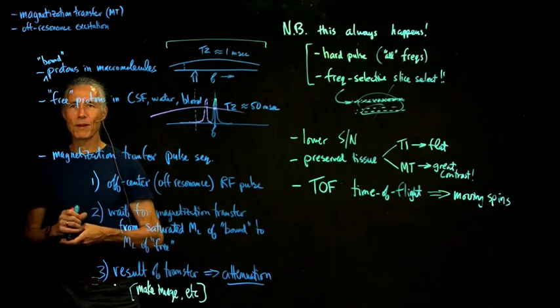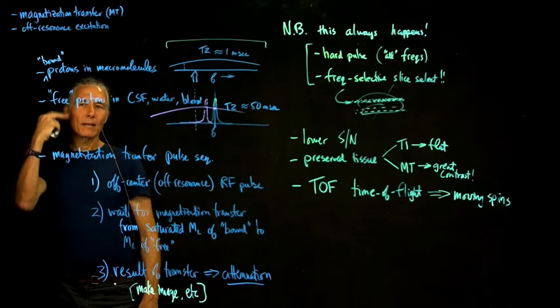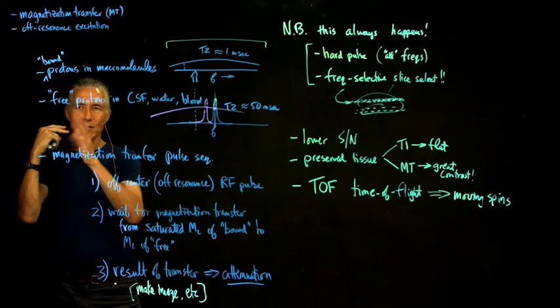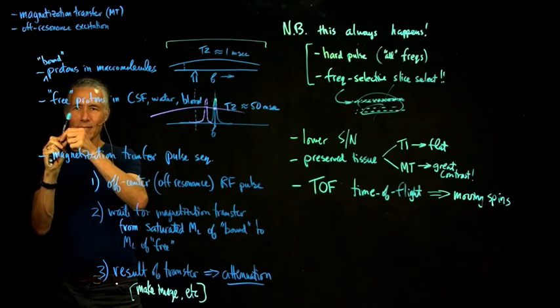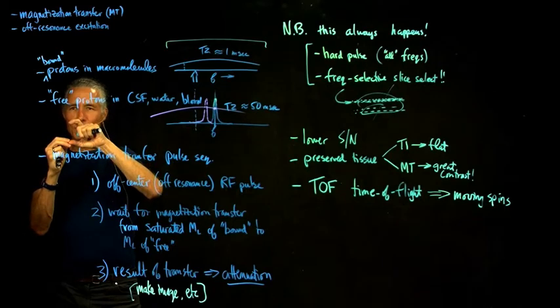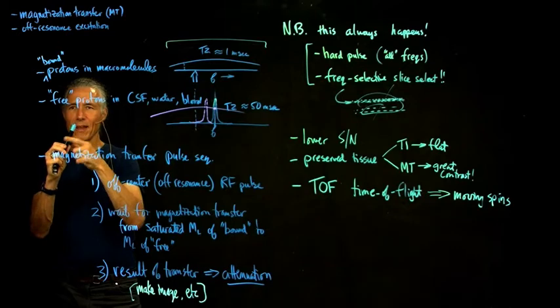What's causing it to be bright is that you're imaging away at the head and the neck, and so you're saturating these spins, and you're constantly tipping them, and you've got your longitudinal magnetization going down because of your constant hammering at them.